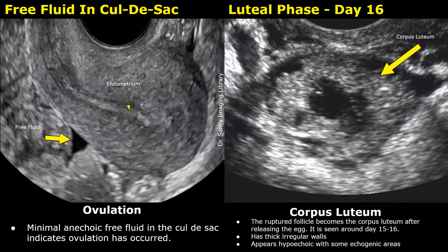A small amount of free fluid in the pouch of Douglas, or the cul-de-sac, is also a sonographic sign of ovulation — you will find a small anechoic fluid collection behind the uterus. The image on the right shows a corpus luteum on day sixteen with thick, irregular, echogenic walls and a hypoechoic center.